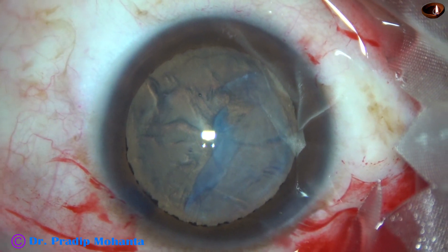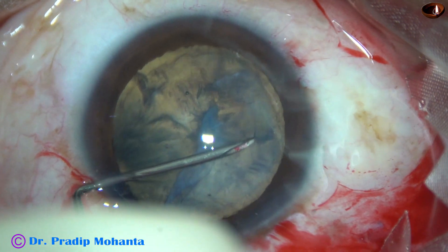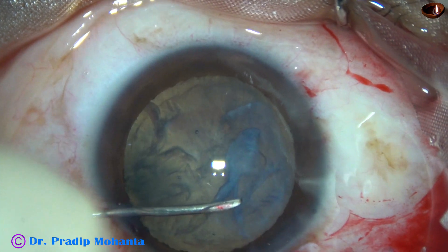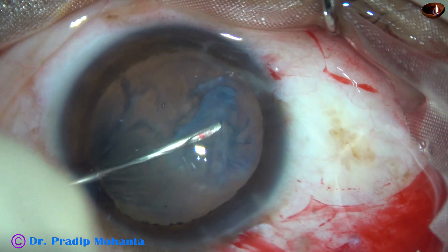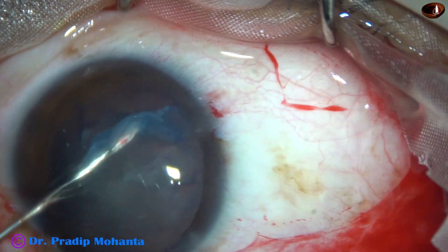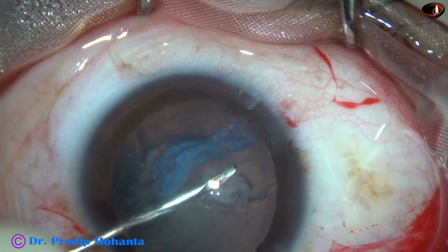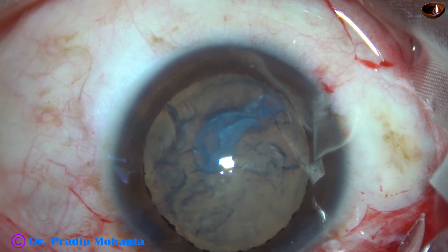Now I have taken the needle and I'm trying to make some more openings — and somehow pull it. It has come out from this side. As I go like this, nicely it is coming out. I didn't think it will be so easy. Almost the whole fibrous plaque is detached — only at one point at eight o'clock is it still attached to the anterior capsule.